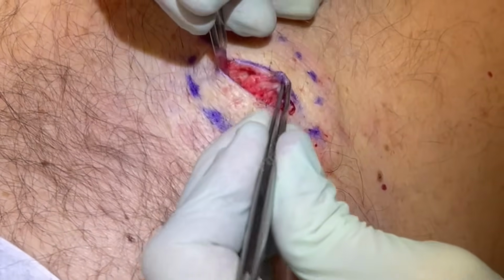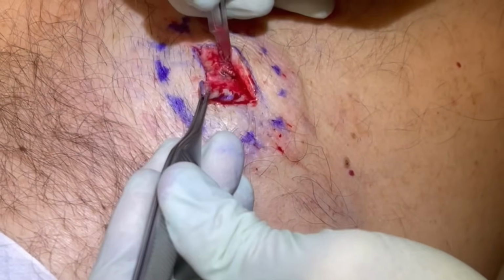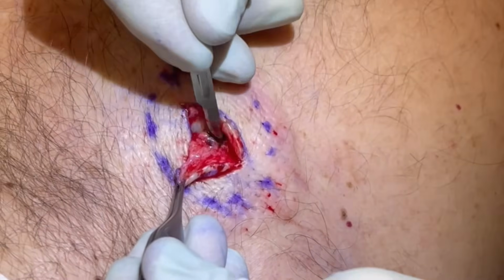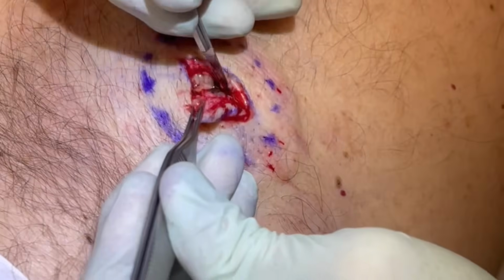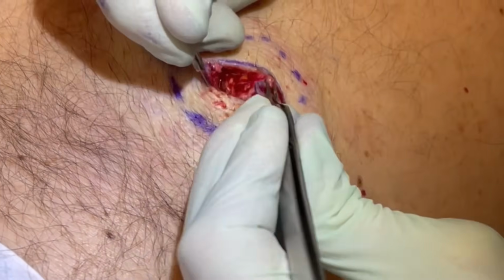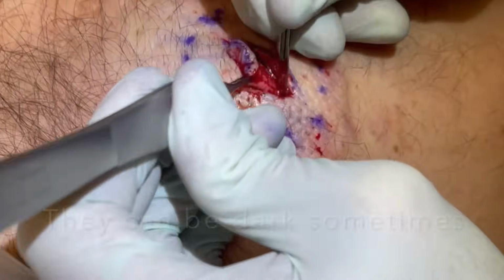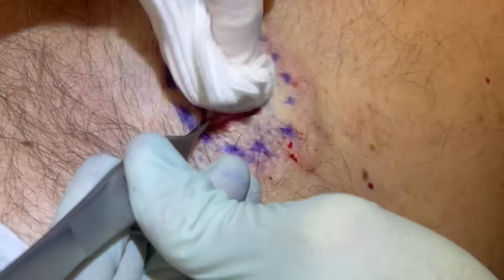A lot of very fibrous adhesions around it there, which is normal. Yeah, there's some kind of dark cyst contents there. It looks like this cyst may have been there a while, very dark. You can see there, it's interesting. Sometimes, when I was saying what felt like a calcified cyst, these cysts will be in there a long time and harden up so much, there's no contents to come out. So that's what we're going to see. This one's definitely a dry one here. This one's not going to pop anything, so don't worry.